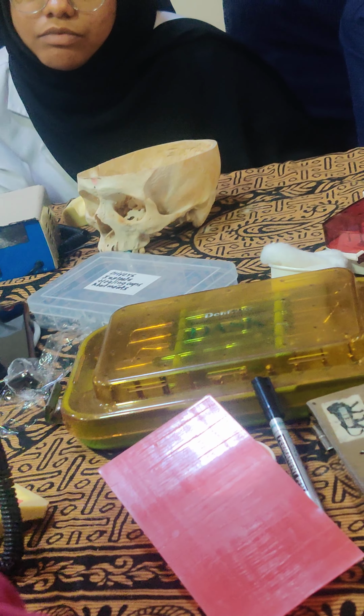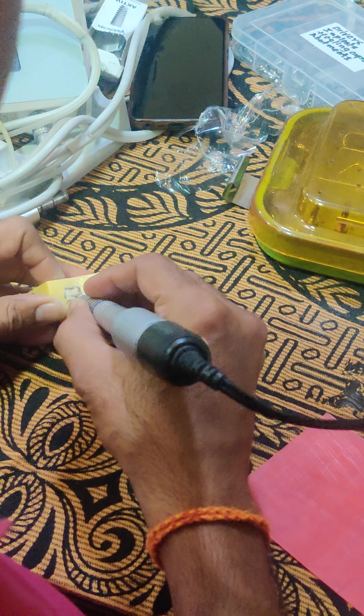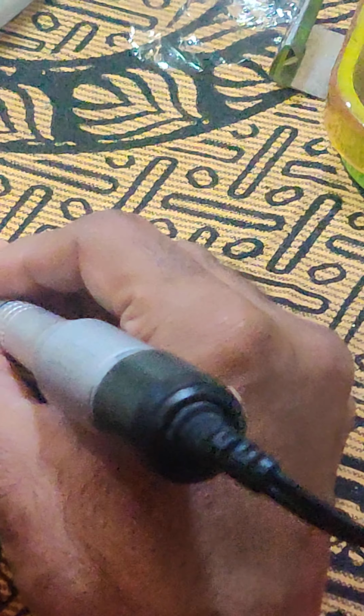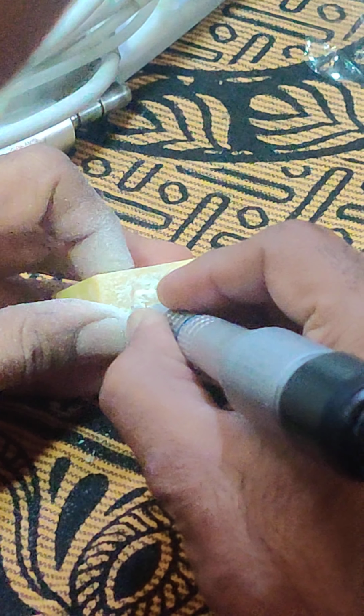Okay, now I am going to open the window. There are different ways. Again, while working on a patient, we just do the scoring, 1 millimeter, 0.5 millimeter. Once we do the scoring, if you tap the bone with any blunt instrument, it will fracture. It comes out easily. But as this is a model made up of fiber and sawdust, this is not going to break. And secondly, the thickness of the bone in a patient's mouth is 1 to 1.5 mm. Here what I can see is almost like 8 to 10 mm.